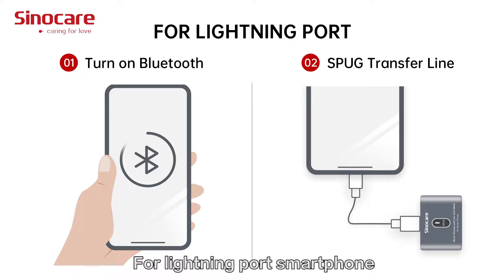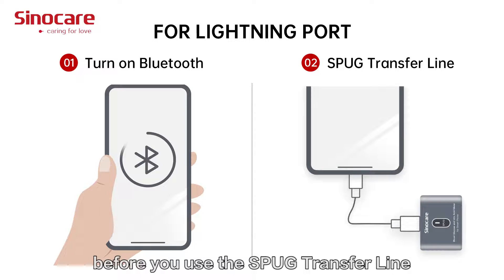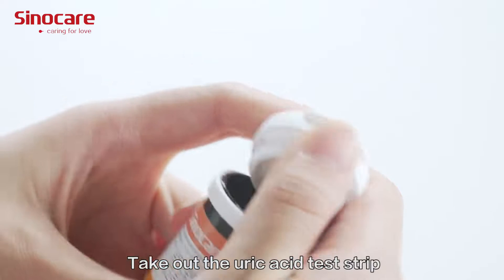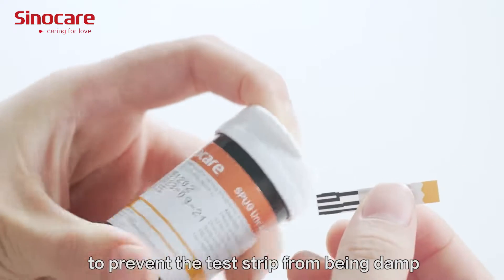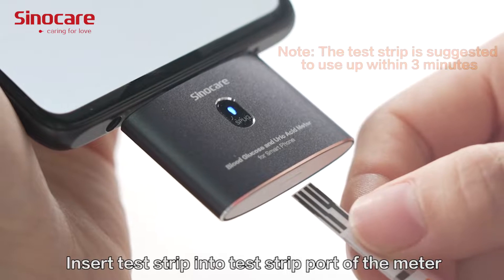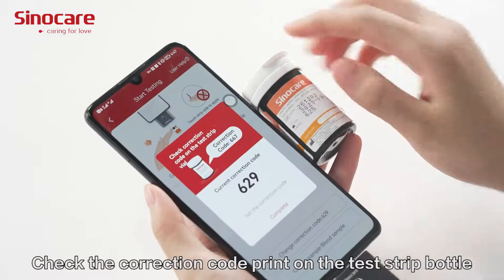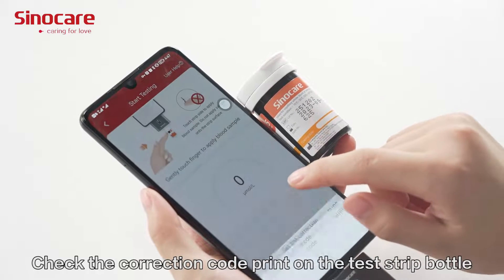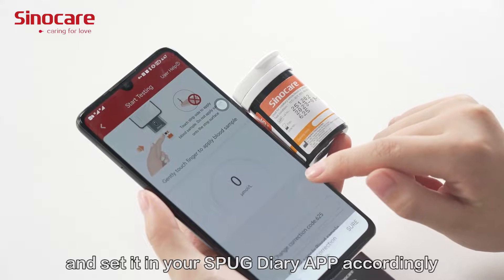For a Lightning port smartphone, please turn on Bluetooth on your phone before using the SPUG Transfly adapter. Take out the uric acid test strip and cover the bottle cap immediately to prevent the test strips from becoming damp. Insert the test strip into the test strip port on the meter. Check the correction code printed on the test strip bottle and set it in your SPUG Diary app accordingly.